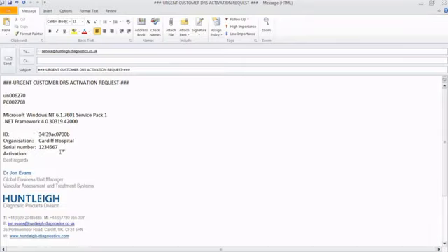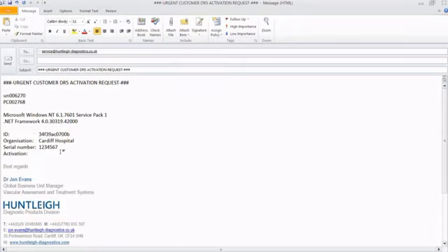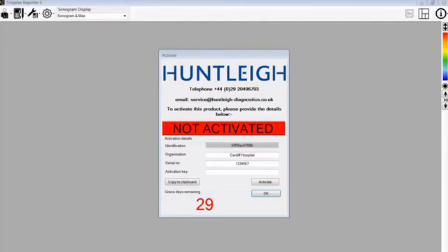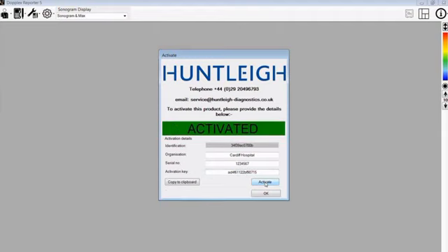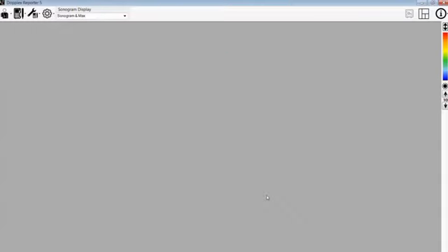When we receive this email, we will send you back an activation key, which can then be copied and pasted into the activation key box. Press activate in the software and you will see the band goes green. Press OK and your software will now become fully activated.